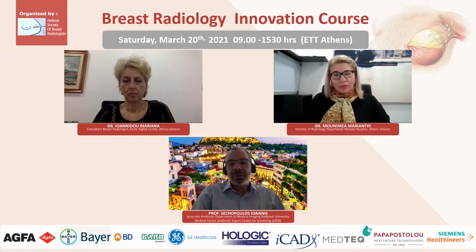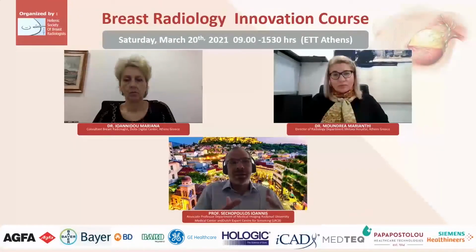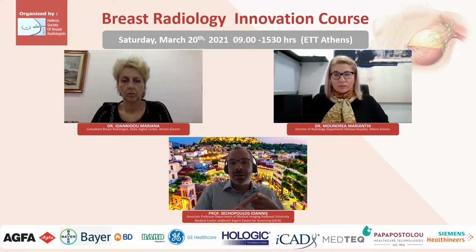In the near future, I think the idea of this hybrid double reading, so having an AI do one of the reads, would be most acceptable. I would ask you, the radiologist, and then it would be interesting for the women, because that is the one in which all cases are read by at least one human radiologist. So there's less of an ethical question.